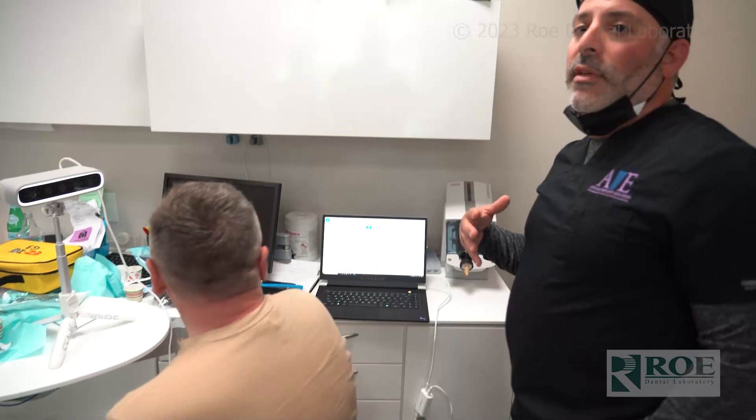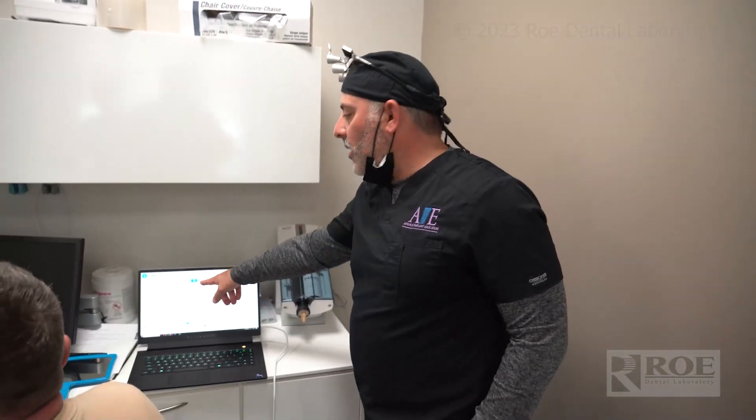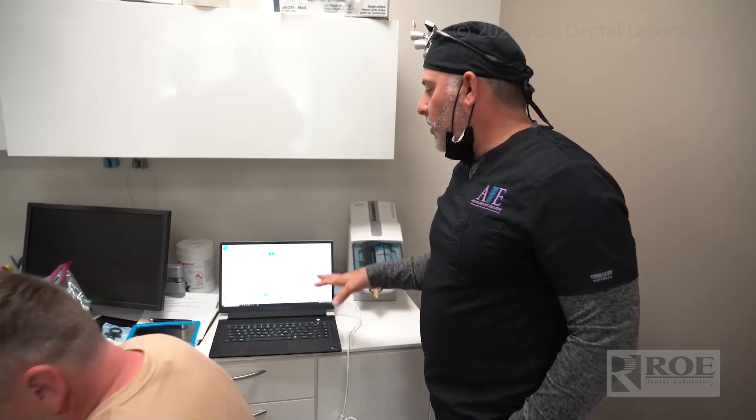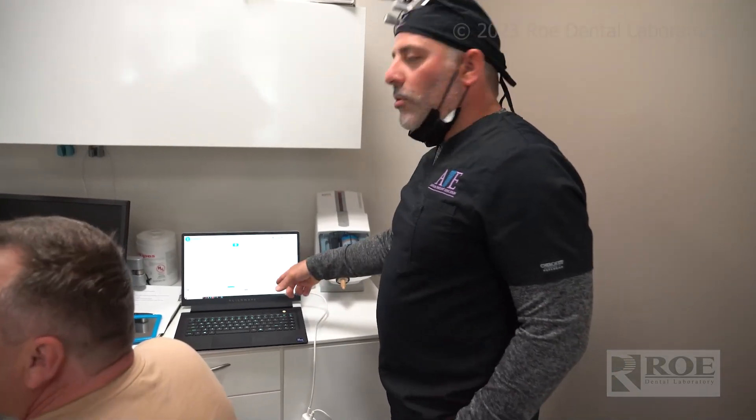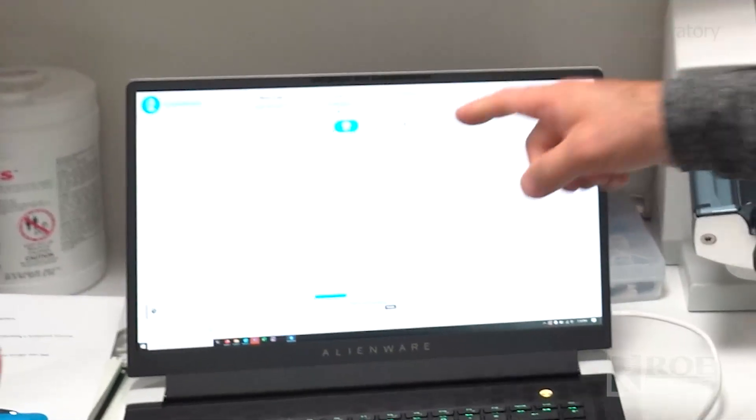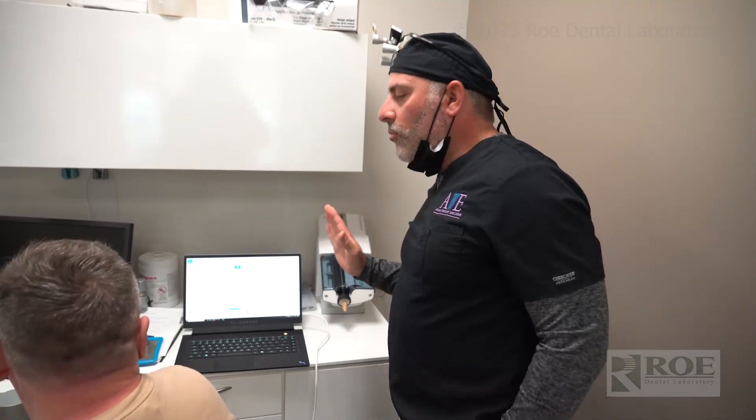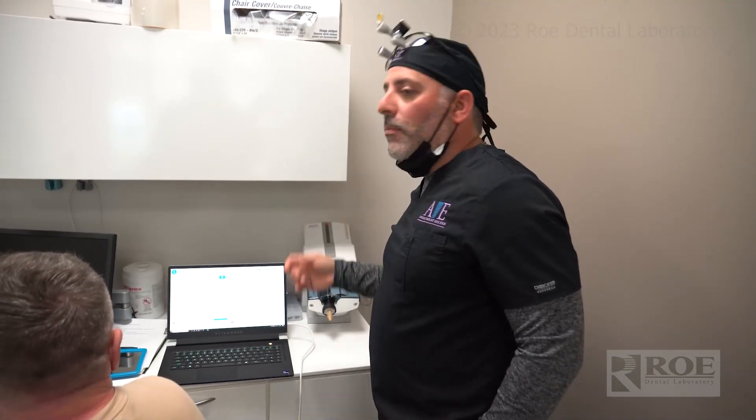Now at this point, if you have intraoral scans, you can actually bring them in on the next slide and it will auto-match them. So we'll have the bite and we can toggle in and out. We'll import them in and you just hit the auto-match button and it matches the top, bottom, and the bite, and you're good to go. So you can then use the transparency to fade the face away and show more of the teeth. And we're going to do a comparison with that once we take an intraoral scan as well.